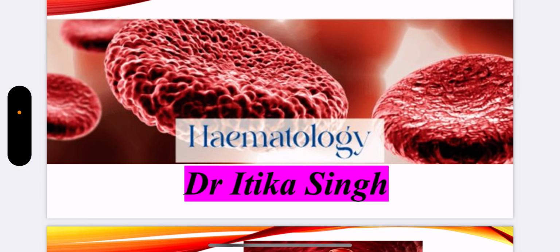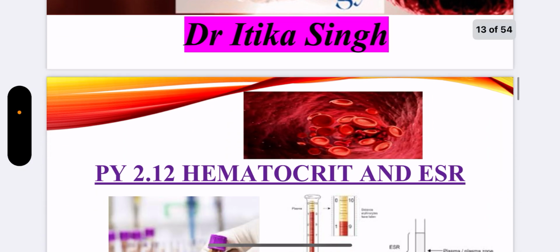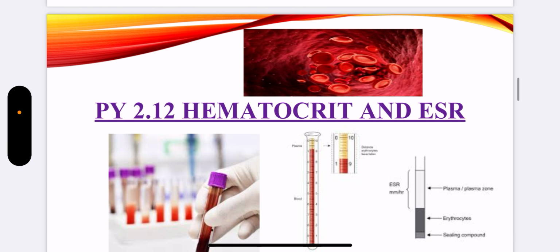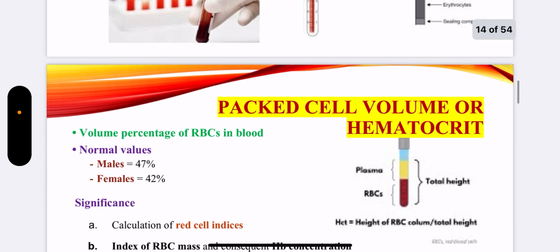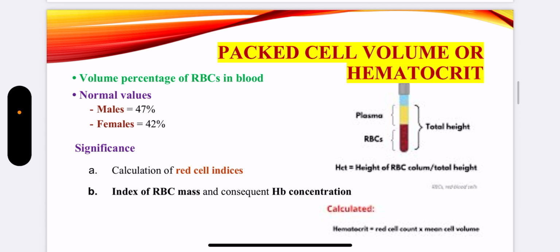Today we will talk about hematocrit and ESR. ESR stands for erythrocyte sedimentation rate. Hematocrit, another name is packed cell volume. It can be abbreviated as PCV.